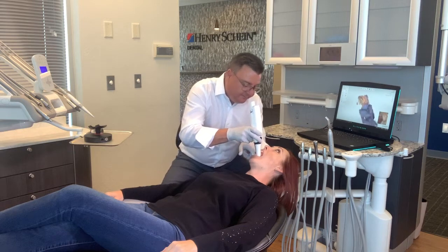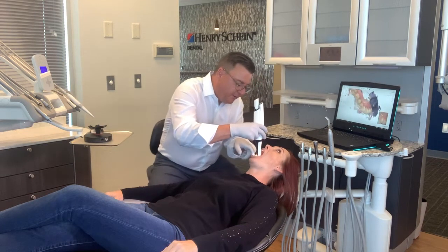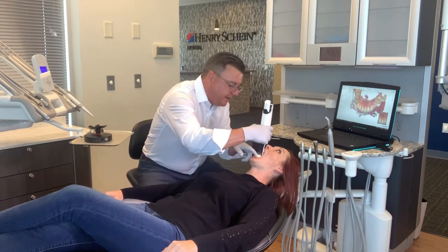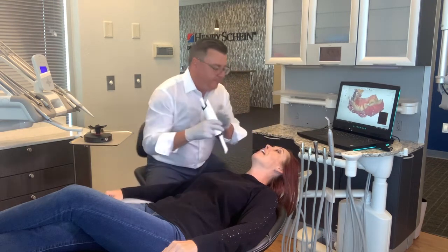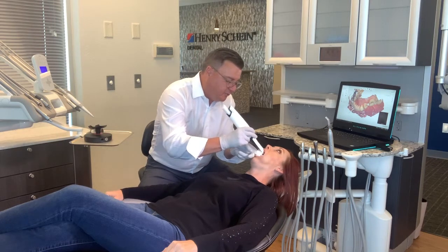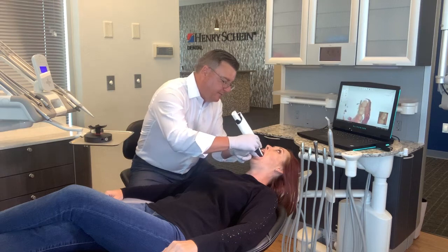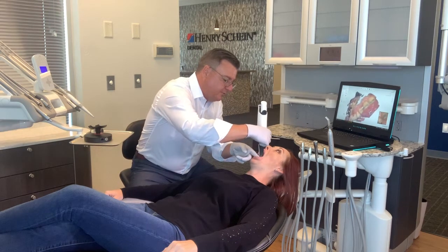One other thing you may notice is that once I've started my scan, while there are some rules in play as to how the scan path should go, we really can jump around a little bit — whatever is most convenient for you and for the patient. We want to keep in mind that patient comfort is of the utmost importance.